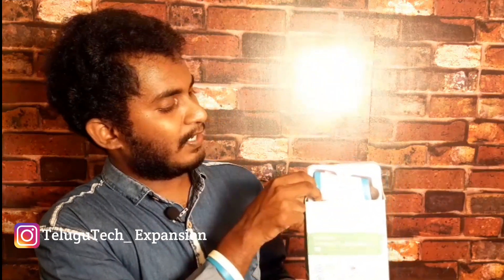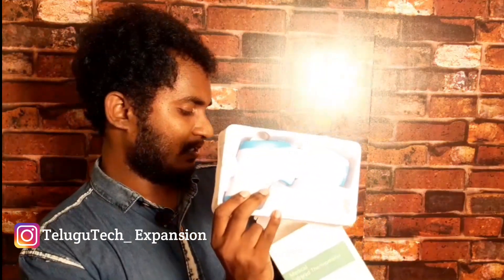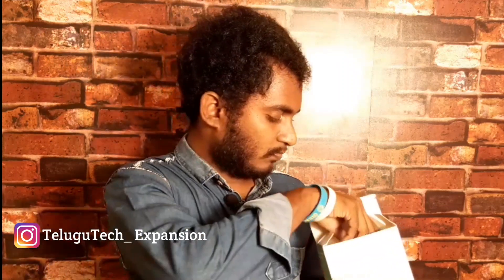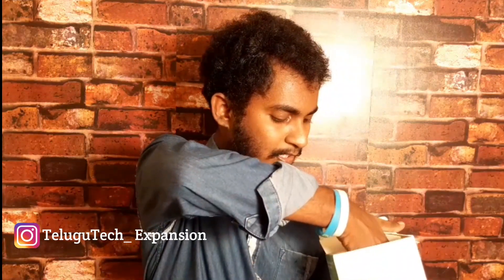I will open the product. This is a manual — it has a certificate. I will show you the device.